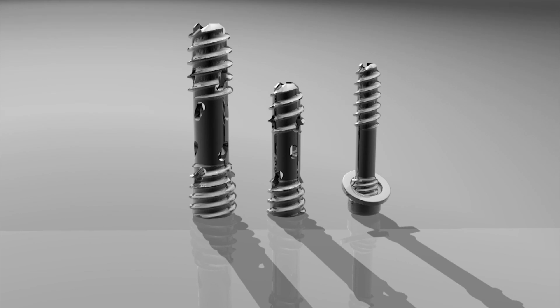CoreLynx's Entasis sacroiliac joint fusion system consists of three compression screws with diameters of 7, 9.5, and 11.5 millimeters. The lengths of the screws range from 30 to 70 millimeters in 5 millimeter increments.